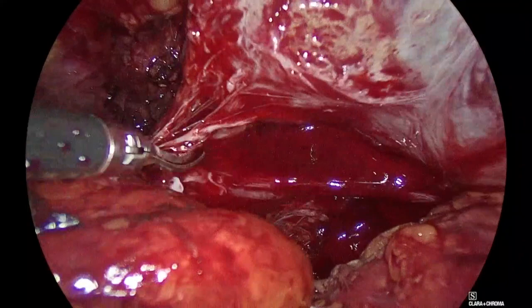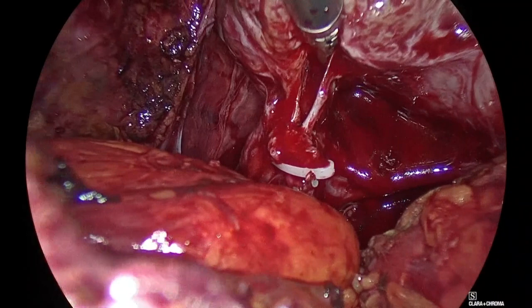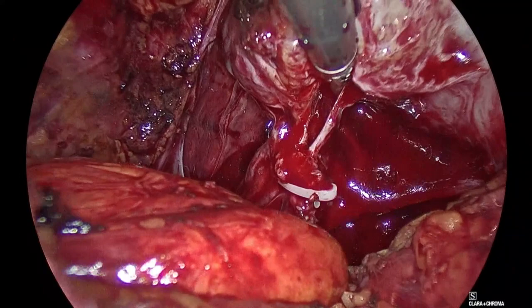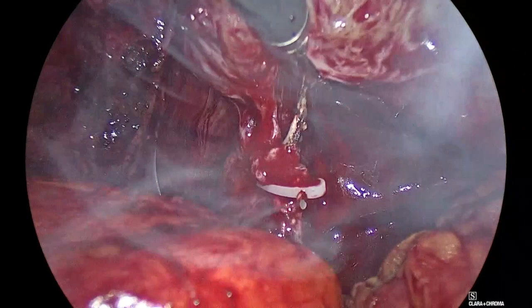Small vessel here. I sometimes use a right angle instrument to develop the tissues before applying the clips. Give me a bipolar. Do you ever do that? Look at this nice vessel there. It's by itself. In this case, I will not clip it. I will bipolar it. Go back, Padeli. Bipolar towards the prostate. Come in. Aspirate my body. Good. Strong grasper.